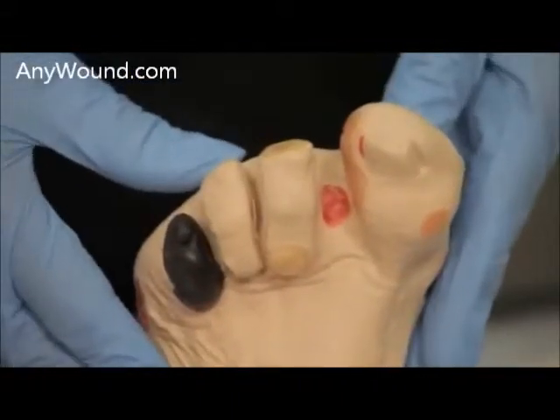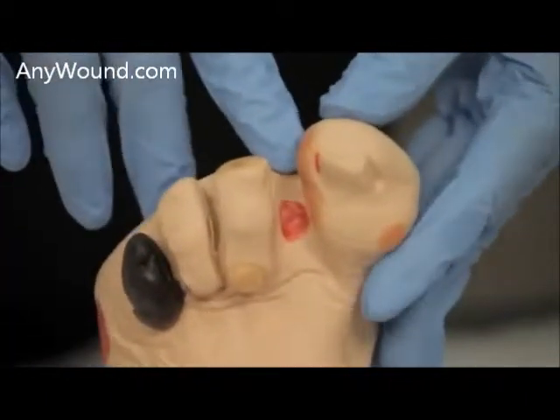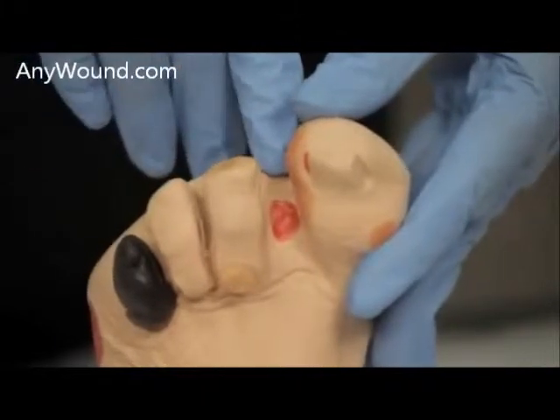My name is Vicki Fishnick, and I will be demonstrating the application of Enluxtra on a diabetic foot ulcer. We will be demonstrating the application of Enluxtra on a diabetic foot ulcer in the web space in this area.